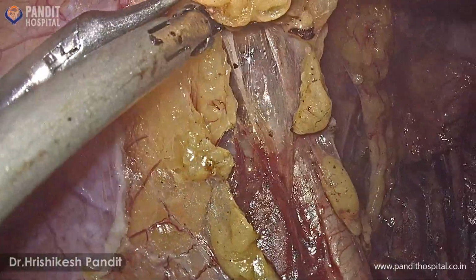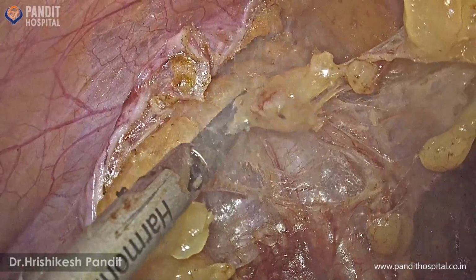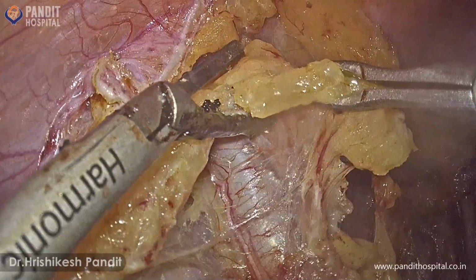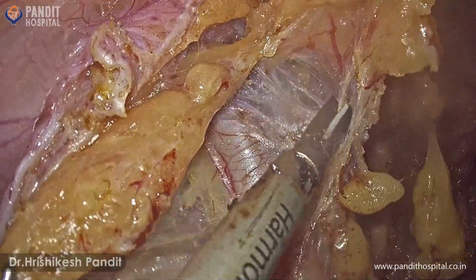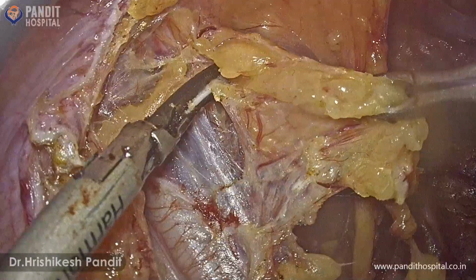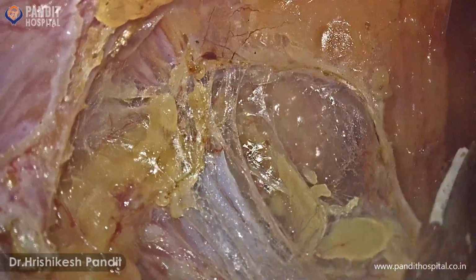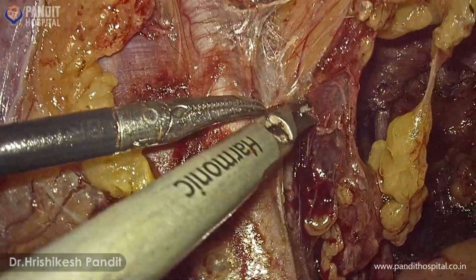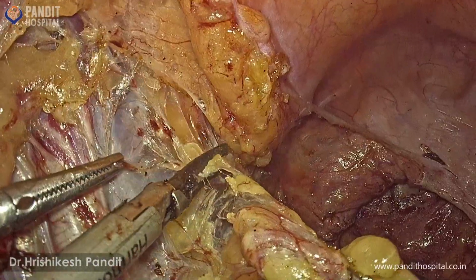Short burst of cutting currents are given. Blunt and sharp dissection is used. We need not send the right and the left pelvic lymph nodes separately for histopathological examination, as if any of the lymph nodes come positive, there is no change in the treatment protocol further.